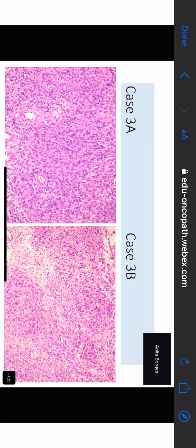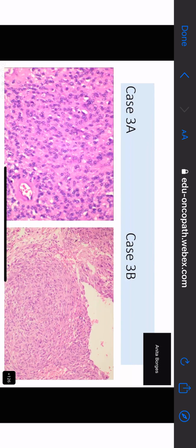Quite a number of them are spindle cells, but some of them are not spindle because their nuclei have taken many different shapes. Some are round, those may be fascicles that are cut, but the others are not like that. See again this nodularity that you are seeing? Here there is monotony. On the other side, that is not monotonous.